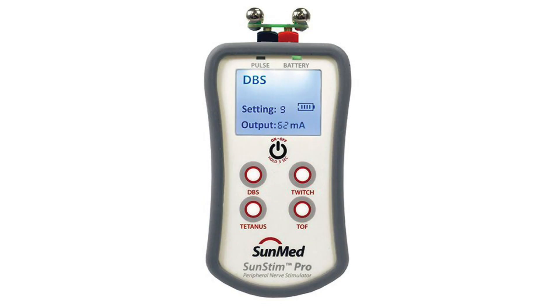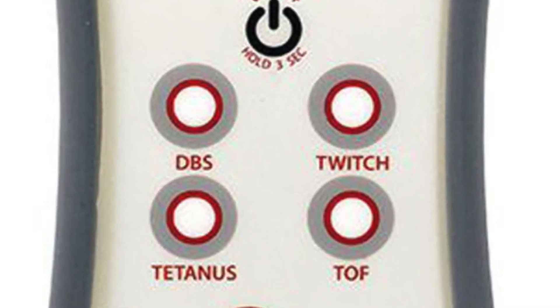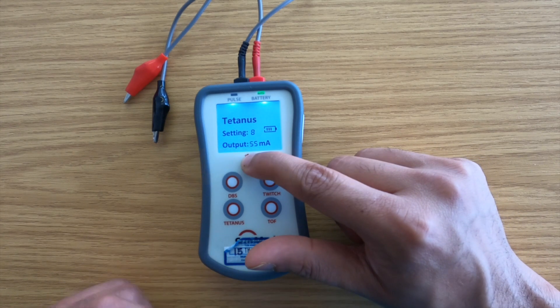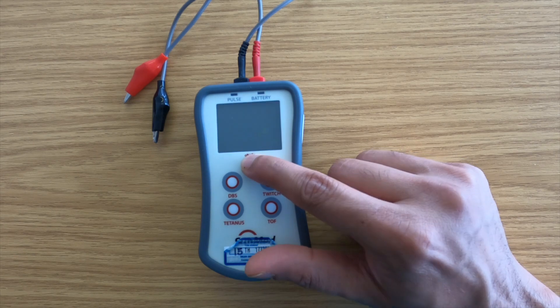Stimulation frequency patterns may be activated by pressing one of four touch panel switches. The pulse LED will flash yellow each time a pulse is generated. Remember to turn off after use to avoid unnecessary battery wastage.